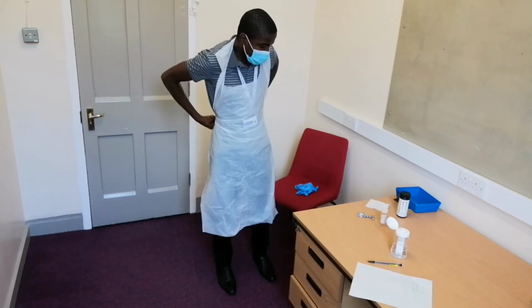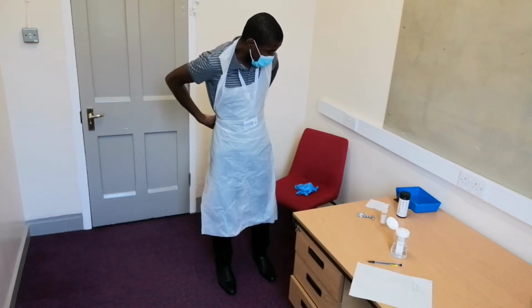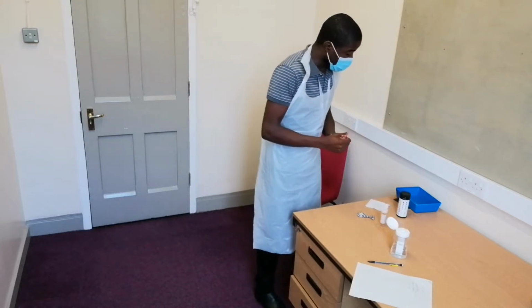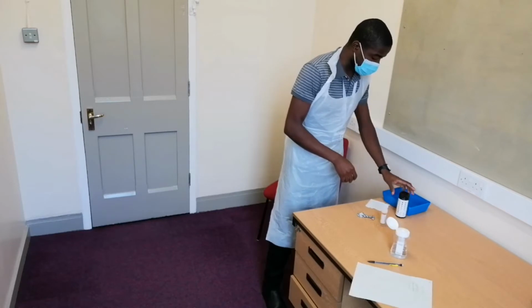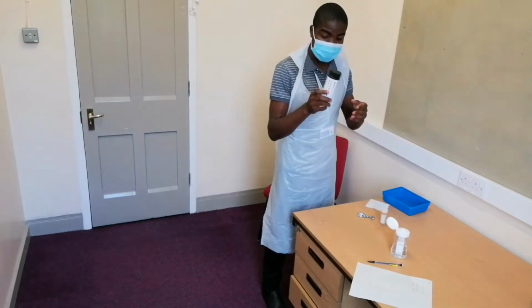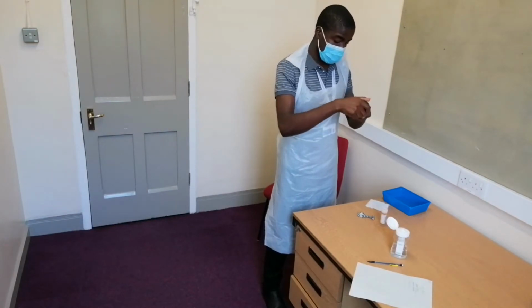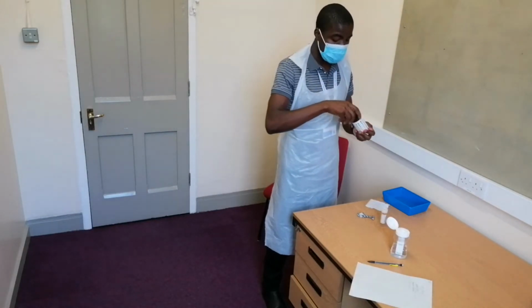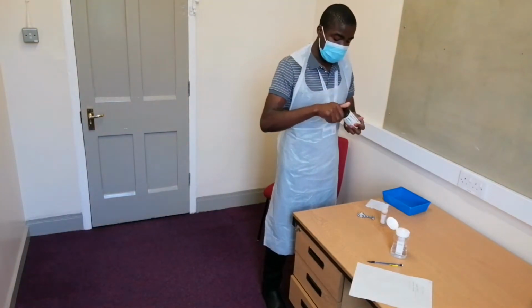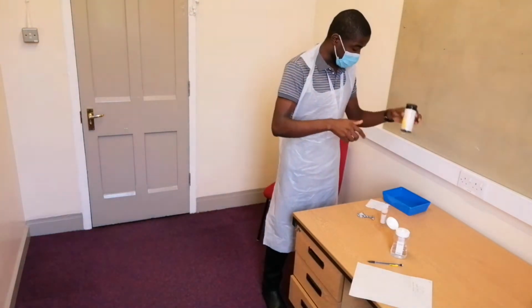Now, assessor, has my trolley and tray been cleaned and ready for use? Yes. Okay, thank you. So for this procedure, I'll require the reagent strip for the urinalysis. It is intact, expiry date 2022. I confirm I have a sufficient number of strips. They are enough. Happy to use.